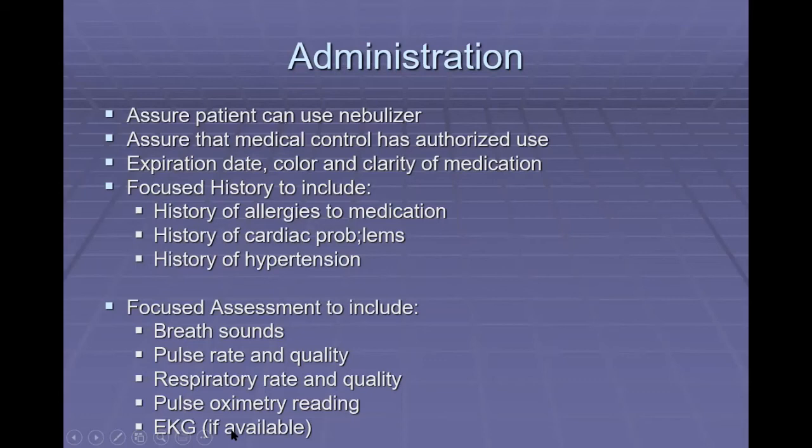Let's take a look at our medication. Let's make sure that it's within the expiration date. Check the color and clarity of the medication. If we're looking at the little ampule, make sure that it's clear, okay?